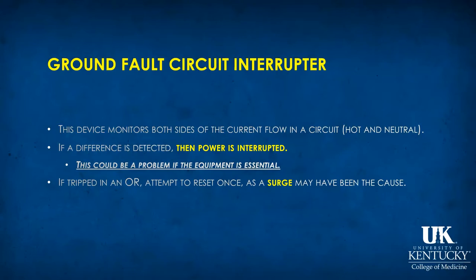If this kind of device were connected to a critical piece of equipment in the operating room, then you would have no power to it. So if, for example, this were a heart-lung machine, then that would be an entirely unacceptable condition for the use of a life support system in the operating room.